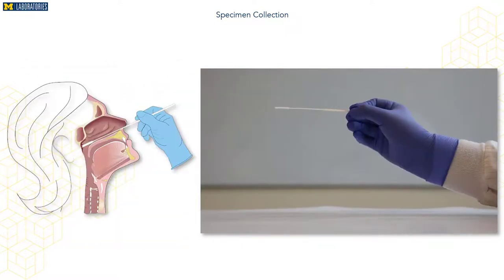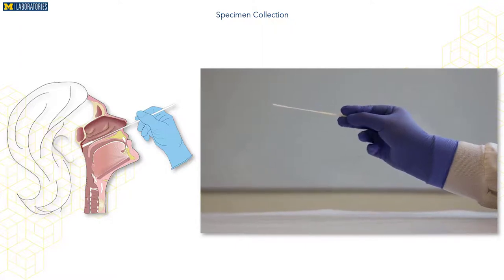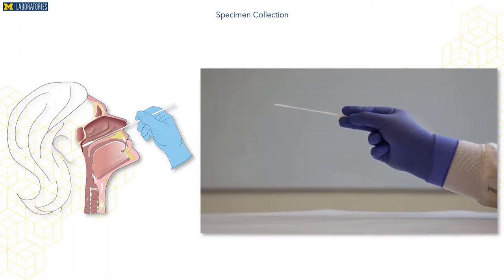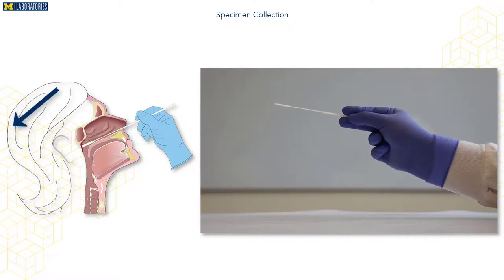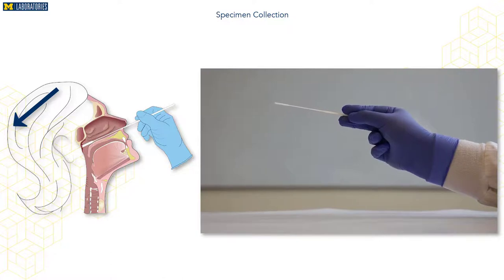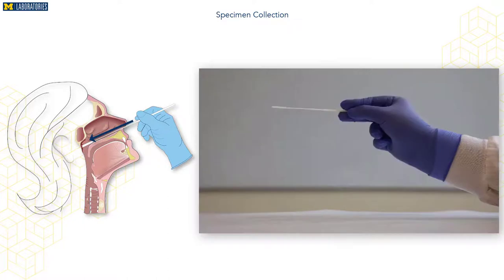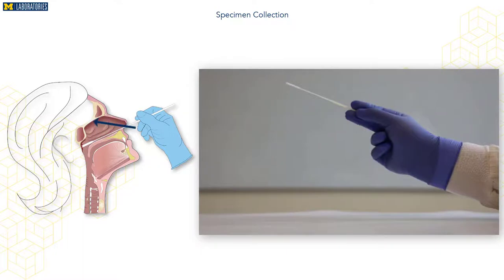To collect the specimen, hold the swab loosely between your thumb and forefinger, with the shaft resting on your middle finger. Holding the swab gently will reduce force within the nasal pathway and reduce the risk of injury to the patient. Before inserting the swab, ensure the patient's head is slightly tilted. If the patient needs assistance, you can gently place your hand on the back of the patient's head. Insert the swab into the nostril, straight back in the direction of the earlobe. Avoid inserting the swab upwards, as there should be no bending of the swab.